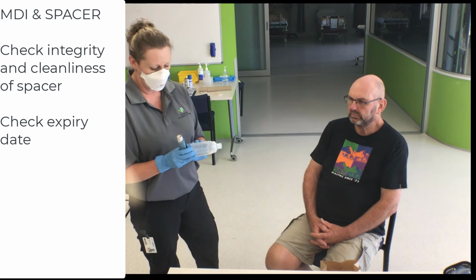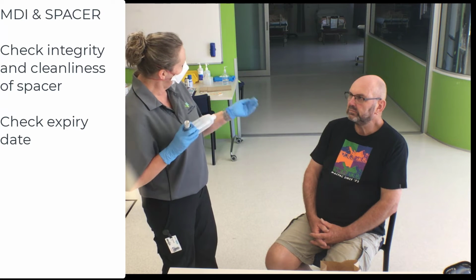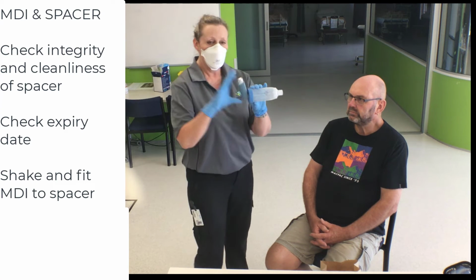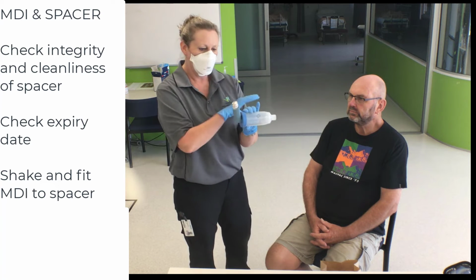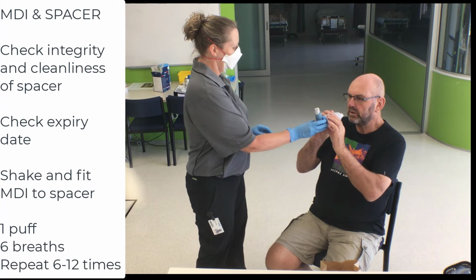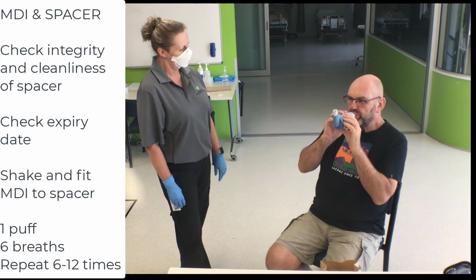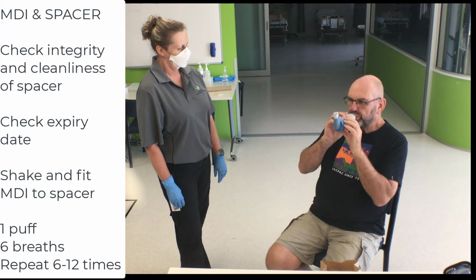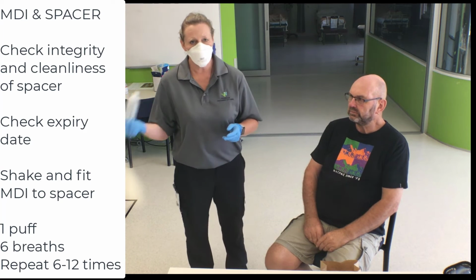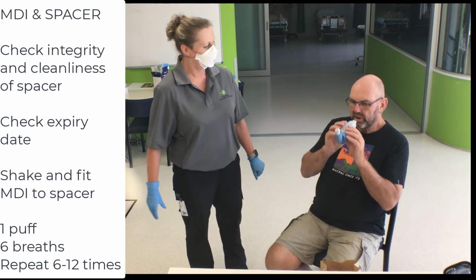They may have used a spacer before, but what we're going to do, Don, is I want you to just breathe in and out normally 6 times with your lips wrapped around here. So I can pre-prime this without actually having it in the patient's mouth. So it's 1 squirt, and can you just breathe in and out 6 normal breaths? Just nice and slow. 6, fantastic. We're going to shake it again, and another 6 breaths.